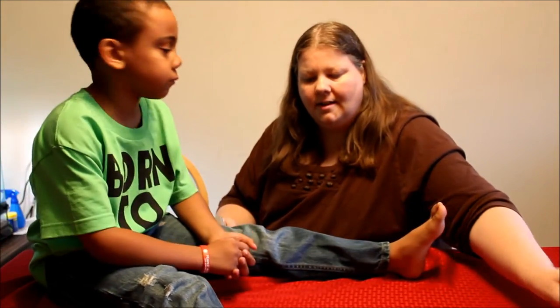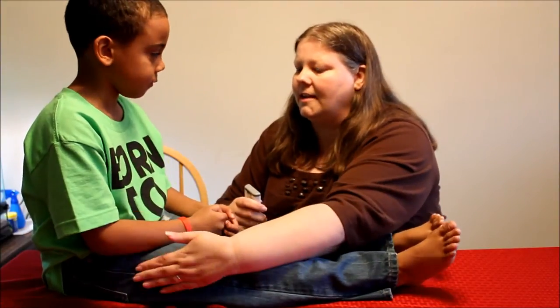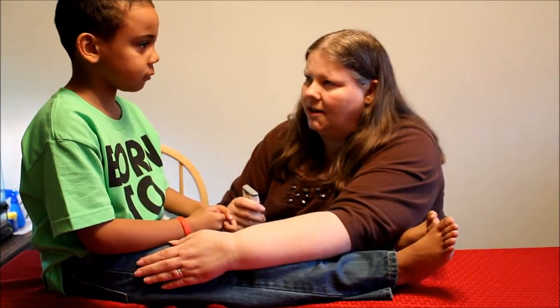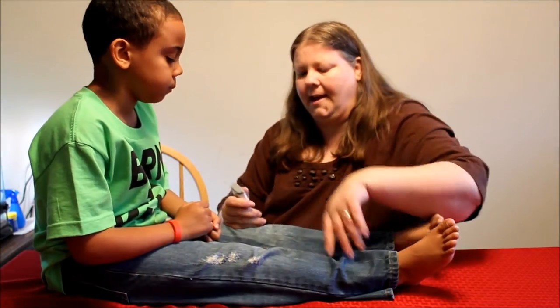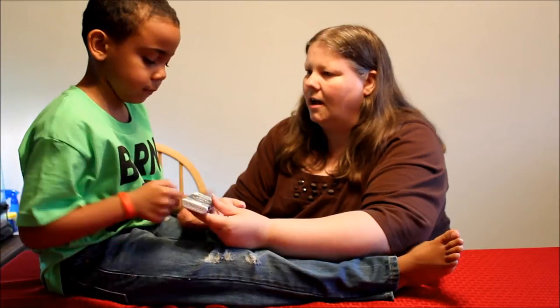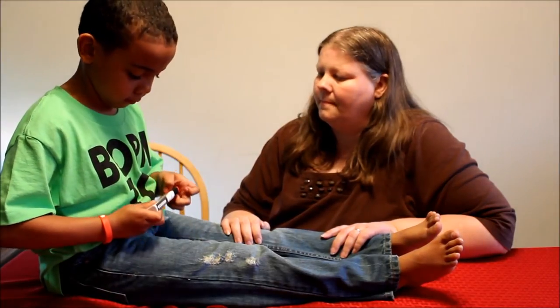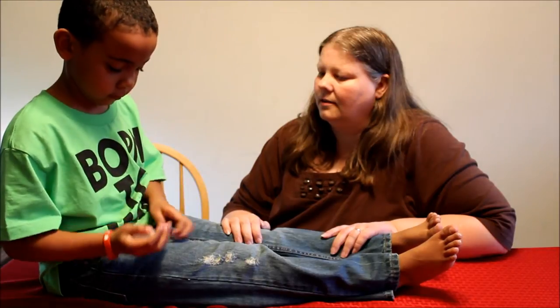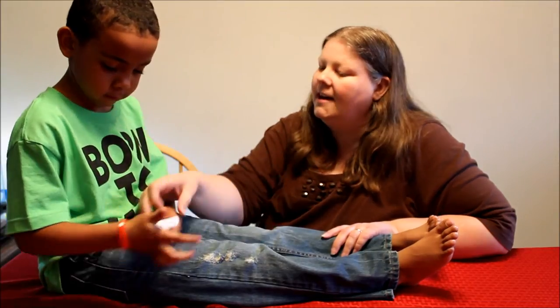Sit here so we can see your face on camera, put your foot out straight. Do it on the outside of your thigh. Once you take your epinephrine, lean back and lay down. Let's say you accidentally ate a peanut and you know you're having a reaction — what do you do? Place the black end against your thigh, press, hold — five, four, three, two, one — injection complete, pull it away from your leg.